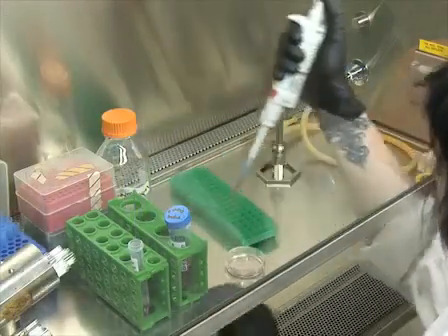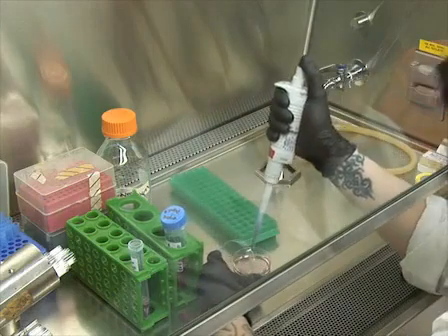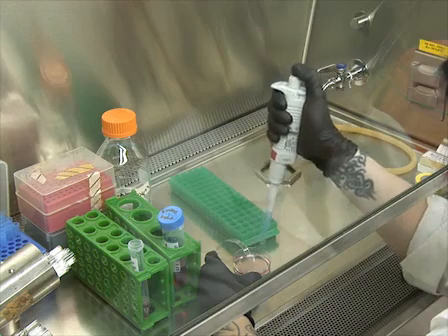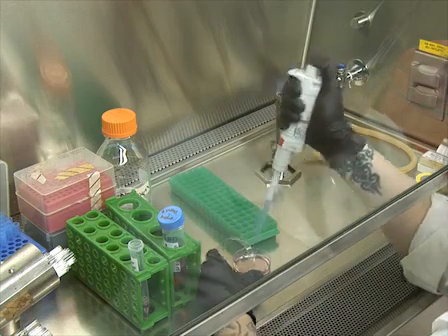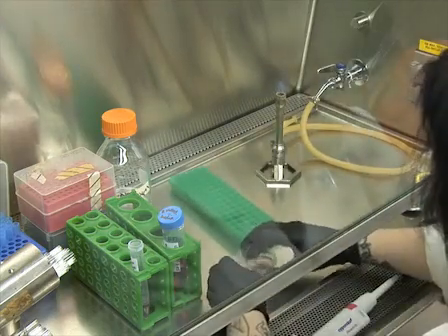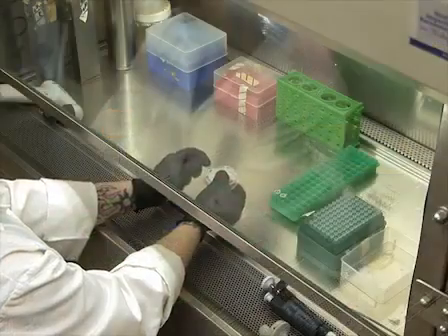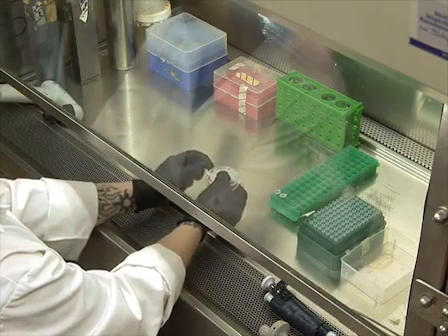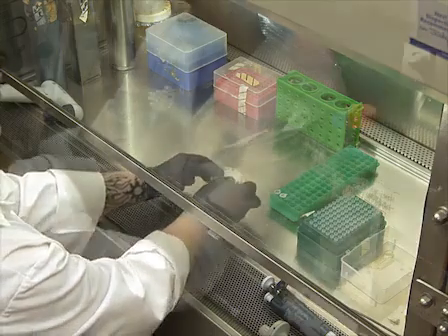Plate the cells in low adherence dishes at a density of 2.5 times 10 to the 5 cells per dish in a final volume of 5 milliliters of maintenance medium. If low adherence dishes aren't available, you can use Petri dishes. In this case, you'll have to tap the neurospheres in the morning and afternoon every day for the first 6 days so the neurospheres don't adhere to the bottom of the dish.